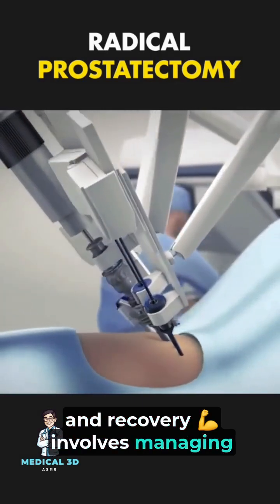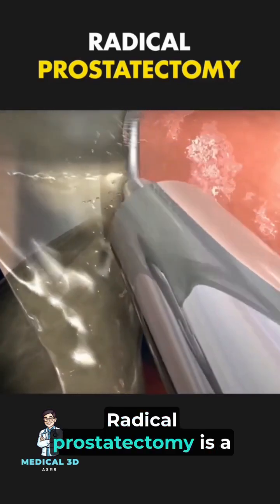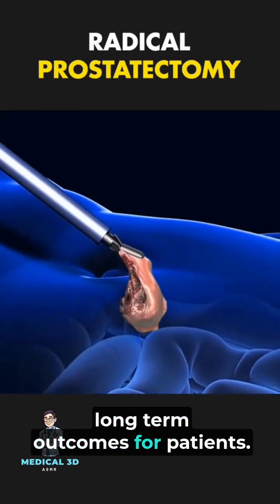Recovery involves managing temporary side effects like incontinence or erectile challenges. Radical prostatectomy is a critical step in treating prostate cancer and improving long-term outcomes for patients.